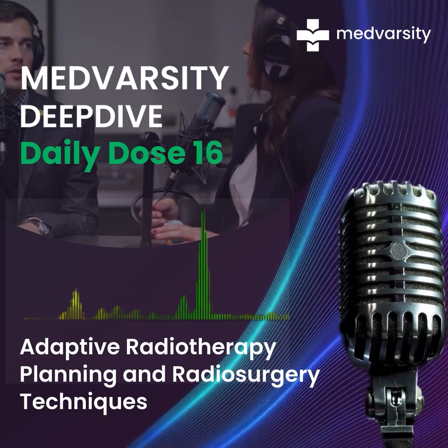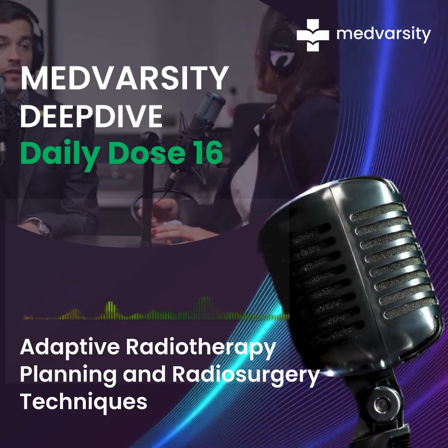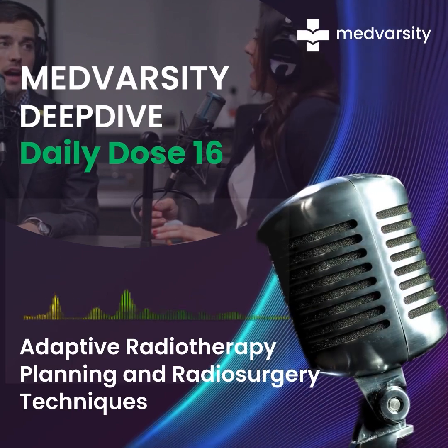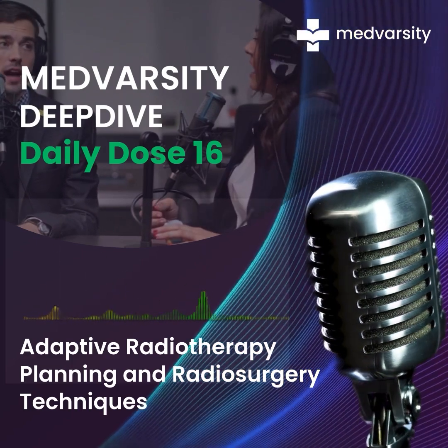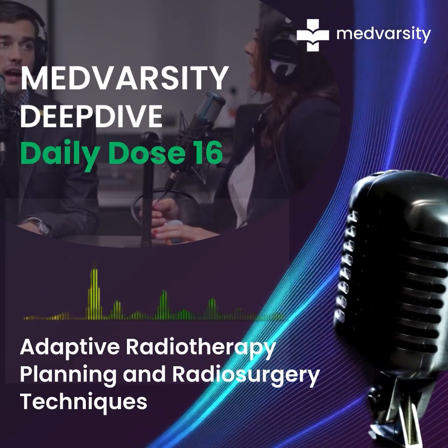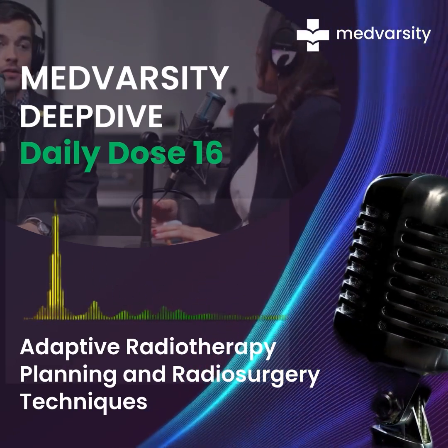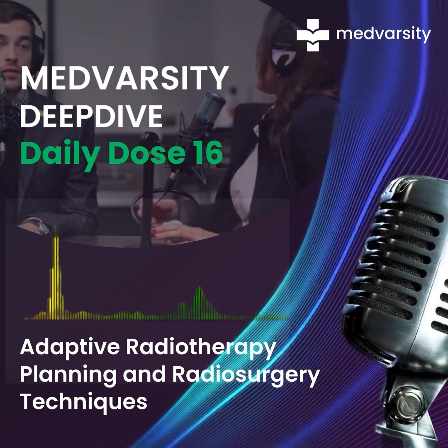That's amazing. Okay, so we've covered adaptive radiotherapy. Pretty mind-blowing, but there's another technique that sounds like it's straight out of Star Trek. Helical tomotherapy. What is going on with that? This is delivering radiation in a spiral pattern, and it uses both a CT scanner and a linear accelerator combined to deliver radiation in that really precise way.